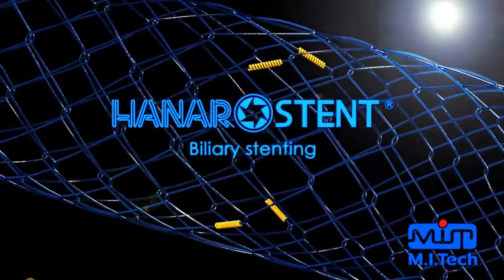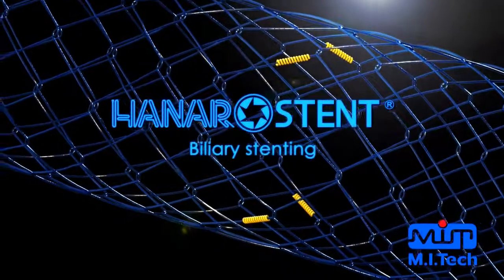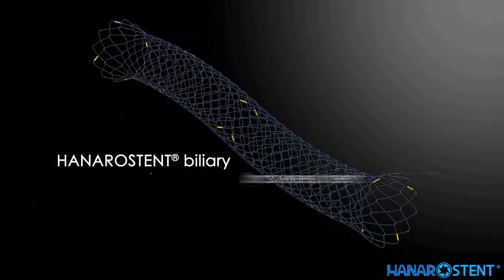Introducing Hanaro Stent for Biliary. Hanaro Stent Biliary Uncovered.